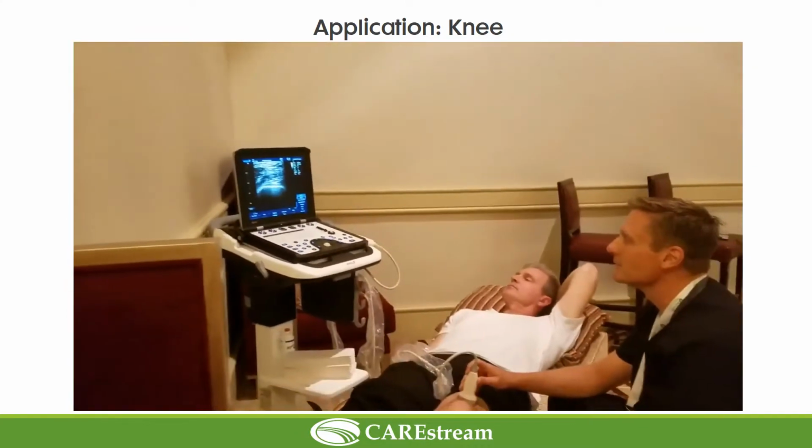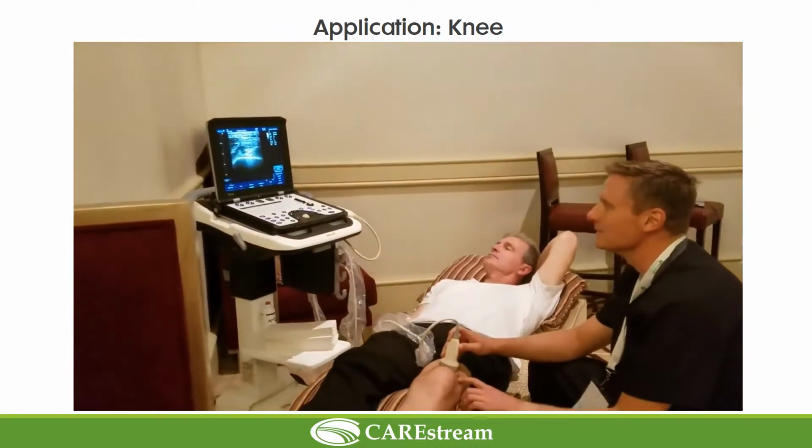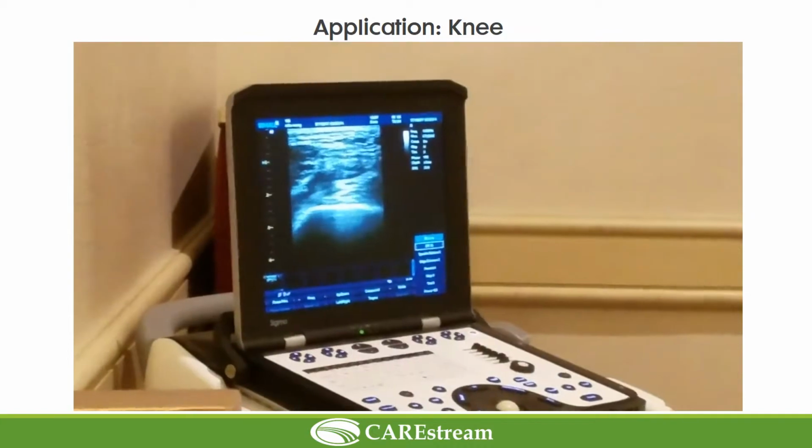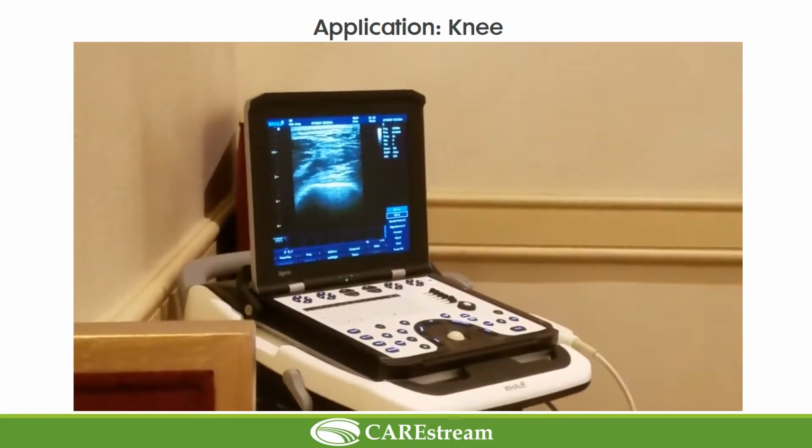So you want your medication to go between those two planes. If it goes between those two planes, you're in this patella recess. It will go into the knee joint.